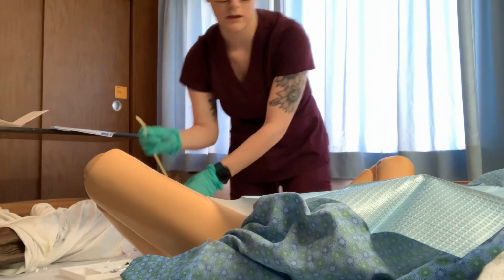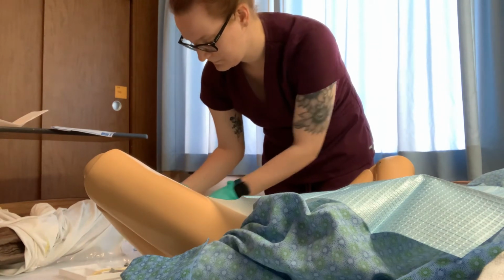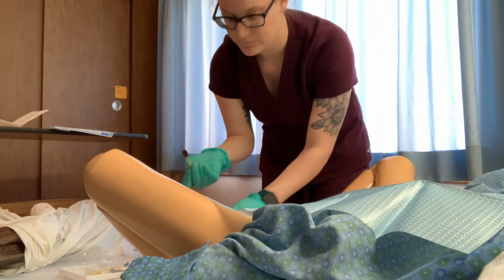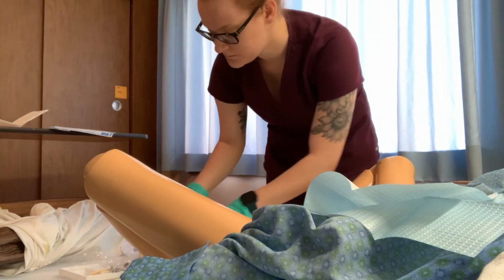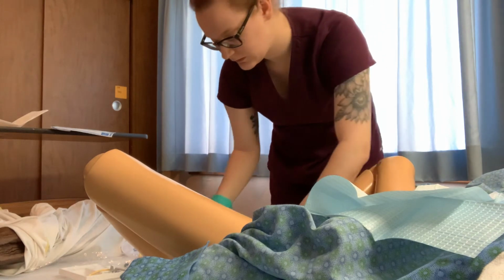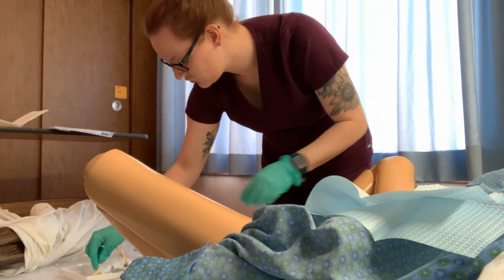Okay, Edna. All right. I'm going to clean you with the iodine. Once down the middle, discard. Once down the side, discard. And once down the other side, and discard. And once the iodine is there, make sure we got the lube.